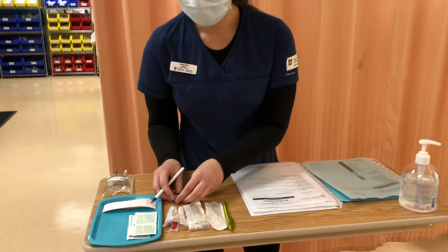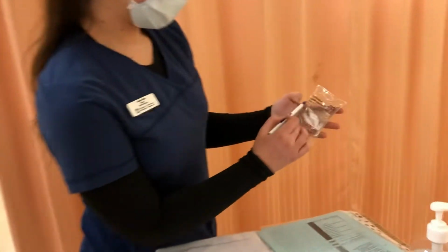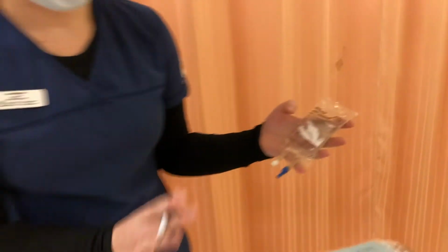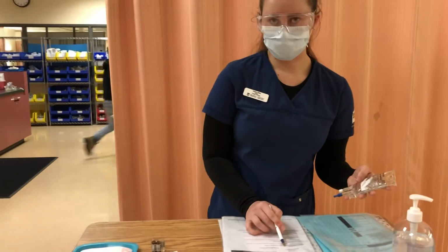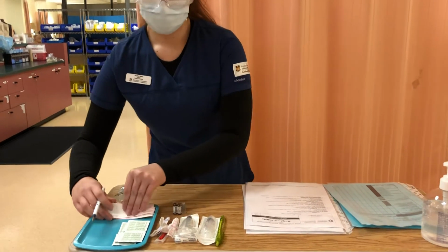So now I'm going to make some medication labels for myself. So I know here I have a 50 milliliter bag of normal saline, not expired, never been opened, but I only want 45 milliliters of normal saline. So I will be pulling up and discarding 5 milliliters. So I'm going to make a medication label for the syringe that is going to hold that normal saline.